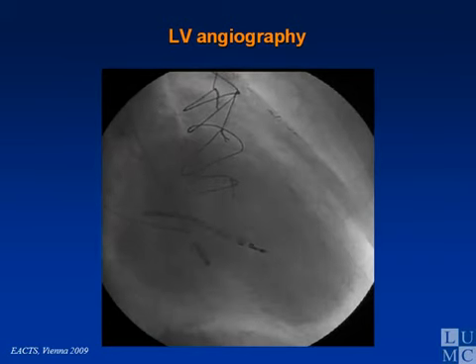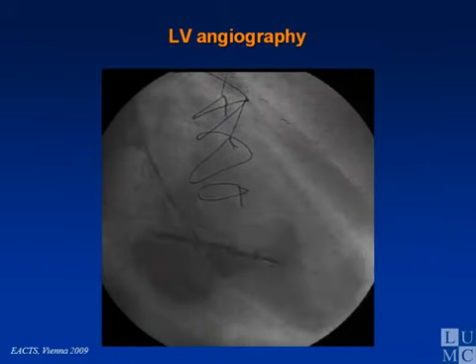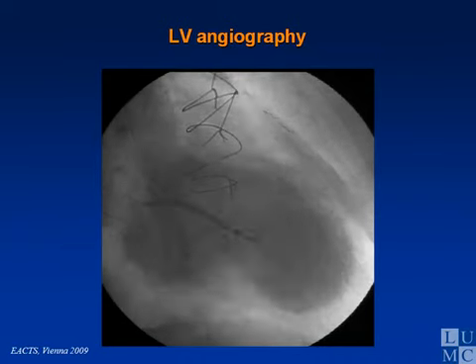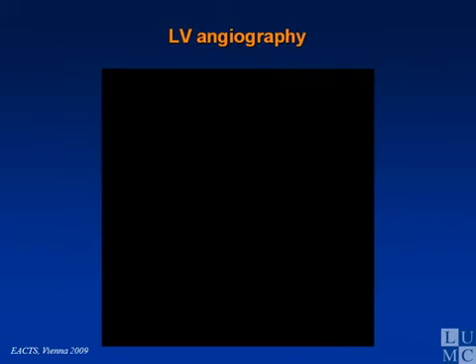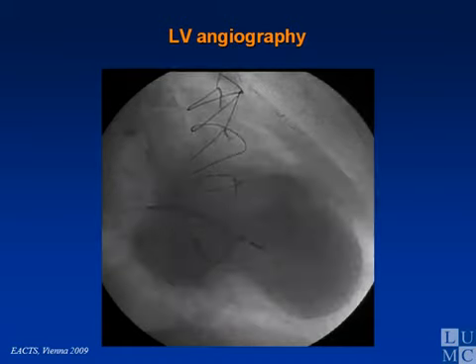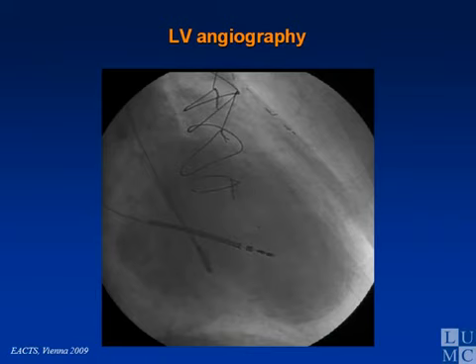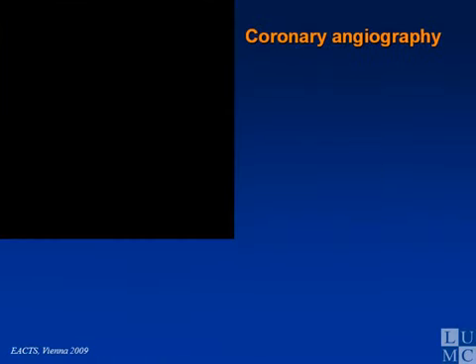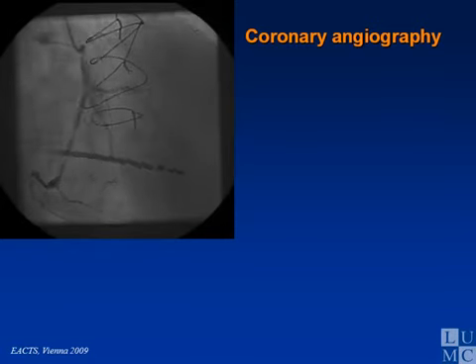Now, for various reasons, this patient did not get the workup we usually do, because we would like to have an MRI, but this ICD prevents having an MRI, and that's actually the case in the majority of our patients. So that's the first problem. Second problem, I think this patient should have a viability scan or any proof that there is no viability in the anterior wall, but we couldn't do that in the short time that this patient was admitted. But if you see the coronary angiography, you'll see what the problem is.